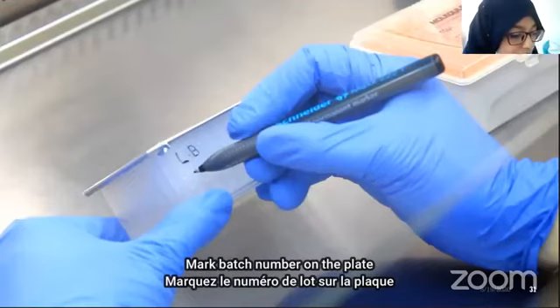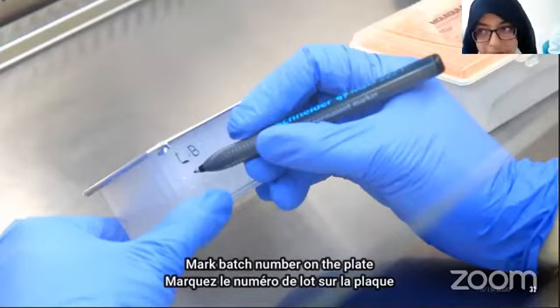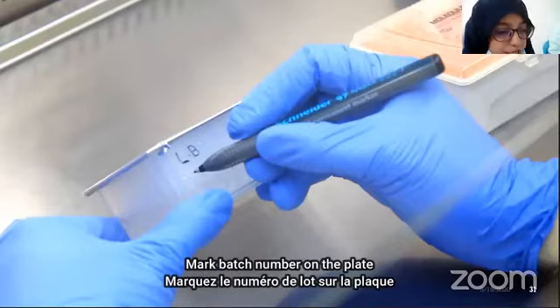Sample pooling for testing several samples is also an option we can do, but sample pooling is not as such recommended. In this we can pool many serums, many swab samples, and check them. In the pooling process, we add different samples in a well, process them, and extract the RNA.